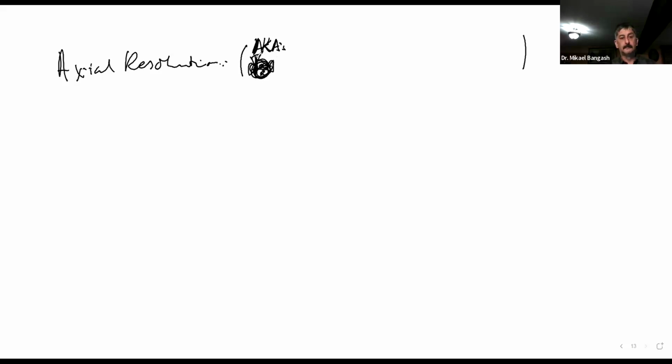Anybody want to tell me what axial resolution can also be known as? Longitudinal.